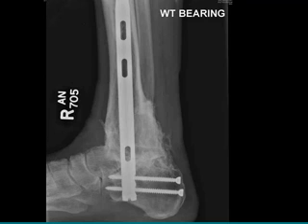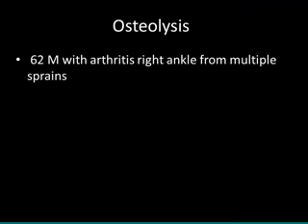Typically, we will use a lot of bone graft. I won't hesitate to put a little vancomycin in the bone graft for protection. We will use a bone morphogenic protein, and we can get a very solid construct. And so it's a nice save for these people and allows them a very functional extremity afterward.